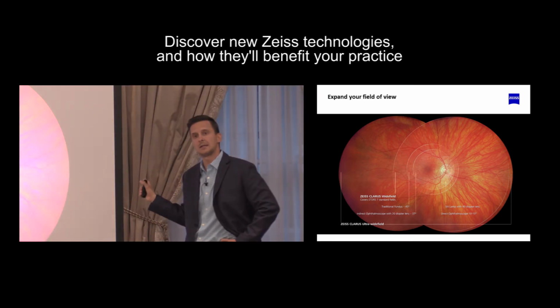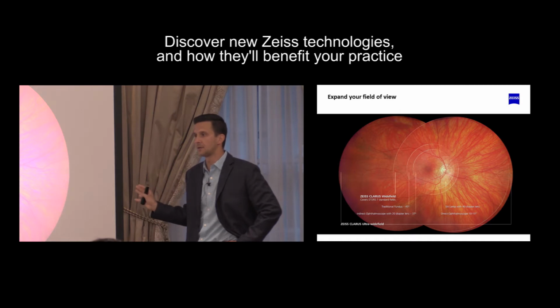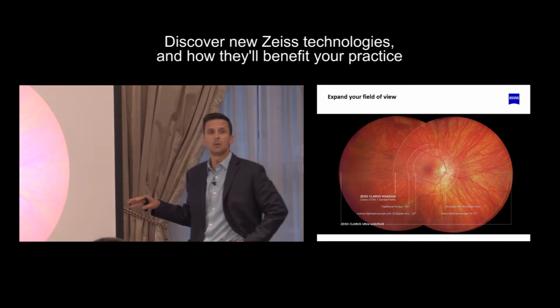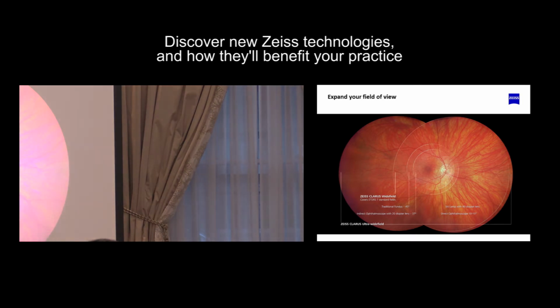These images can be taken on a 2.5 millimeter pupil or larger. Smaller than 2.5, you get too much artifact with it. So keep a couple of those things in mind as you're taking the image. We had a dedicated room that was probably about that big, where we have our field in one corner and we have our Clarus in the other. We took our images in that room where we can control the lighting. We found that wasn't a critical issue.